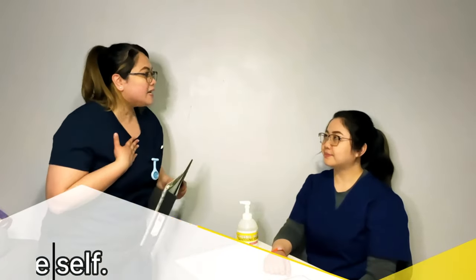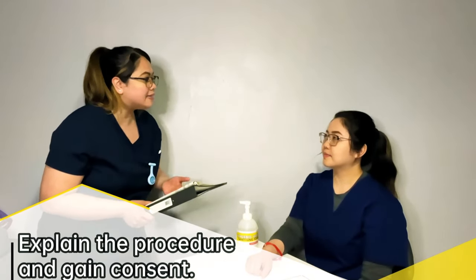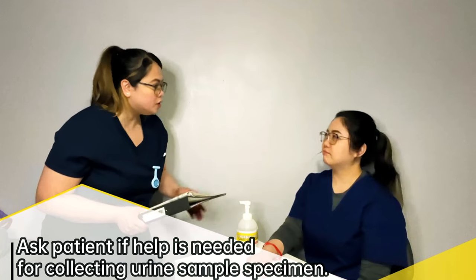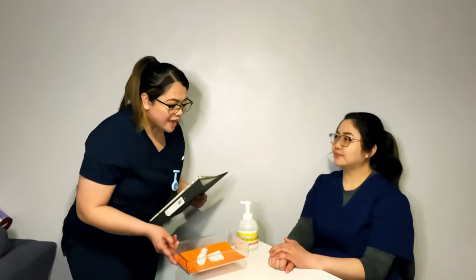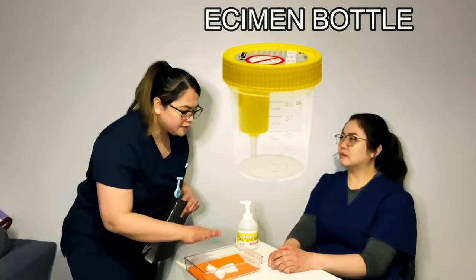Hi, I'm Nurse Nizel, and I'm gonna be your nurse for today. Hello, nurse. I am here to do an MSU urinalysis in which we're gonna collect a urine sample from you. Is that okay? Okay. In this case, do you want me to help you with it or do you want to do it yourself? I can do it by myself. Okay, so if you're going to be doing this, I have here this specimen bottle for the urine, okay, and some wipes, okay?